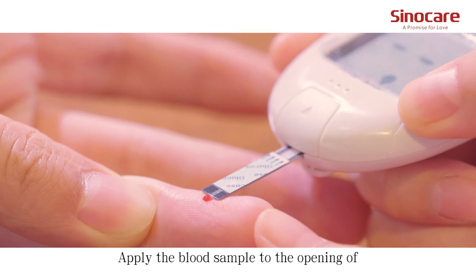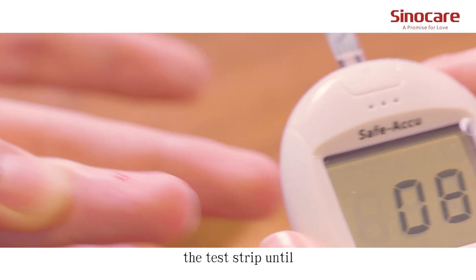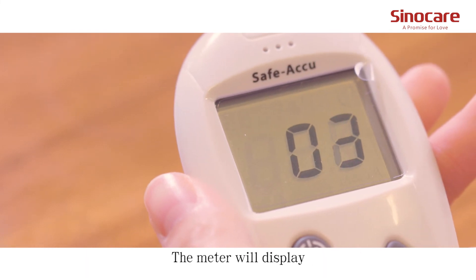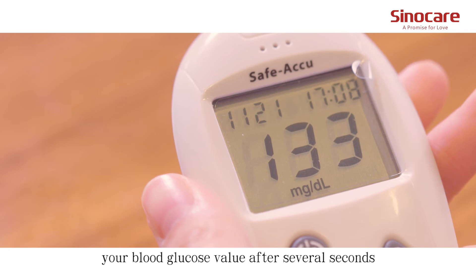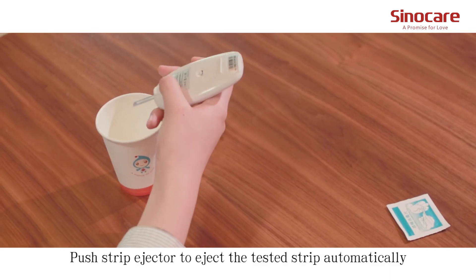Apply the blood sample to the opening of the absorption channel of the test strip until the confirmation window is fully covered with blood. The meter will display your blood glucose value after several seconds. Push the strip ejector to eject the test strip automatically.